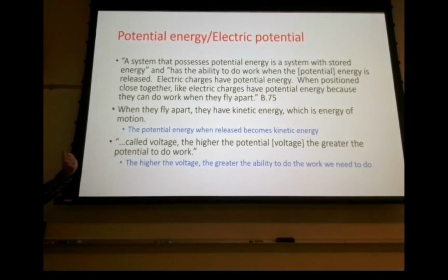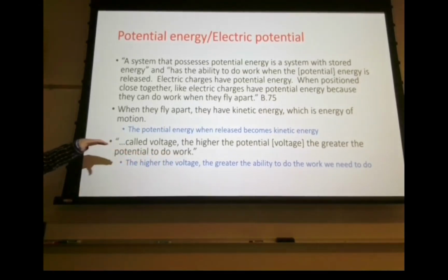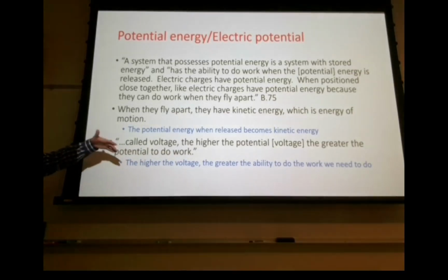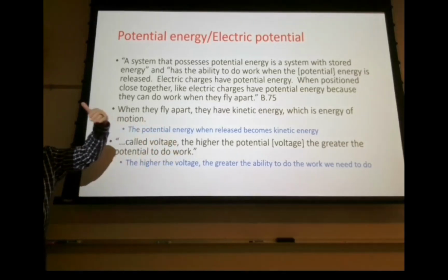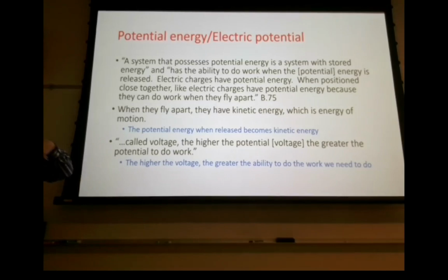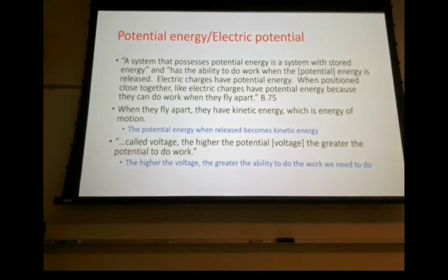So the higher the potential, excuse me, the greater the potential to do work. So the higher the kVp, the more likely we're gonna create X-rays in the energy level that we want to do the work we wanna do, which is penetrate the patient, right?